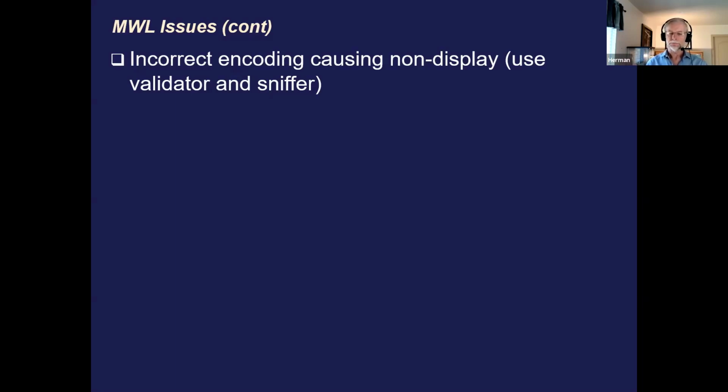They sent me the sniffer files. So how do we troubleshoot it? Well, validators and sniffers. I'll show it to you in a few minutes. We use a validator, which is a simulator, first of all, to do a similar query. We can validate it using validation tools and use the sniffer to make sure that we can see exactly what's going on. So we could prove, yes, we do the query, yes, the result comes back, everything looks great. The fact that it doesn't display must be internal to the ultrasound unit. Then we asked, is there something going on with particular values? And then we used the validator and found out that one of the values was not in an allowed list of values.